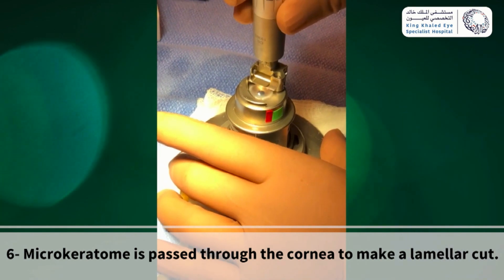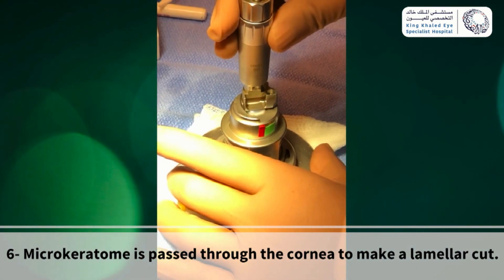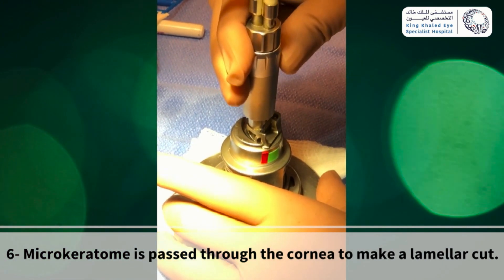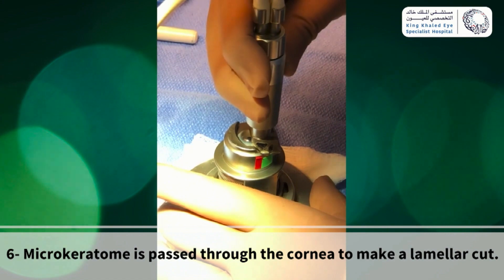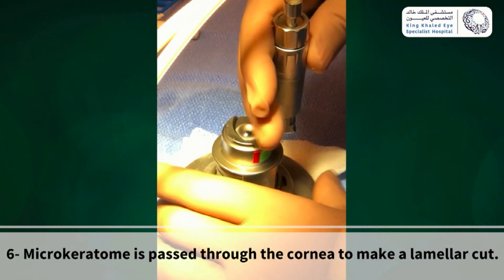Use your index finger and thumb to hold the keratome midway. Press and hold the foot pedal to oscillate the blade. Then with the turn of your wrist, make a smooth even cut through and across the cornea. Then release the foot pedal after you finish and lift the microkeratome straight upward off the unit.